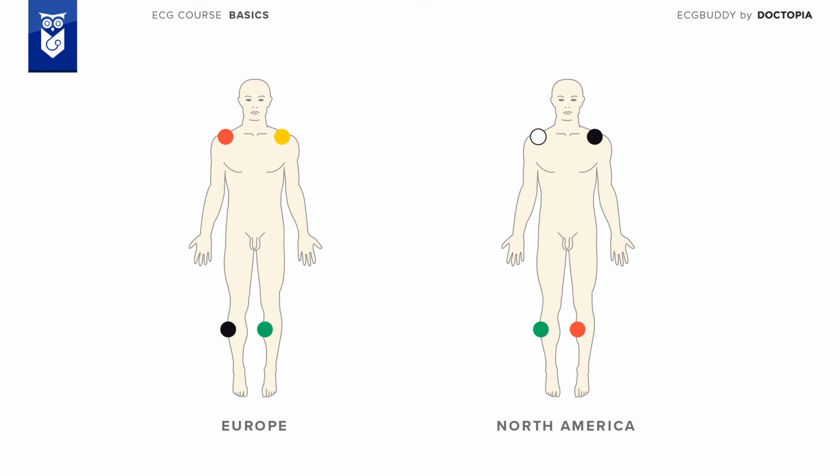However, a combination of inputs from 2 limb electrodes is used as the negative pole, with a different combination being used for each lead. Thus, the angle of the lead is rotated by 30 degrees in comparison with the Einthoven limb leads. For the lead AVF, as in foot, the 2-arm electrodes form the negative pole and the left leg electrode is positive. For the lead AVL, as in left, the right arm and left leg electrodes form the negative pole and the left arm is positive.